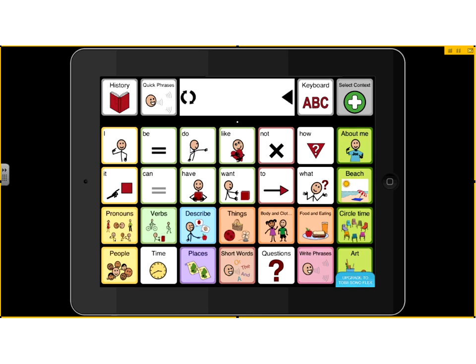But basically what this boils down to is that this app is an easy-to-use AAC app. It turns symbols into clear speech, just like several of the other apps do. This uses a symbol base called the SymbolStix library. Those are the symbols being used. You can see these look similar to other symbols that you'll see, but with slight differences.